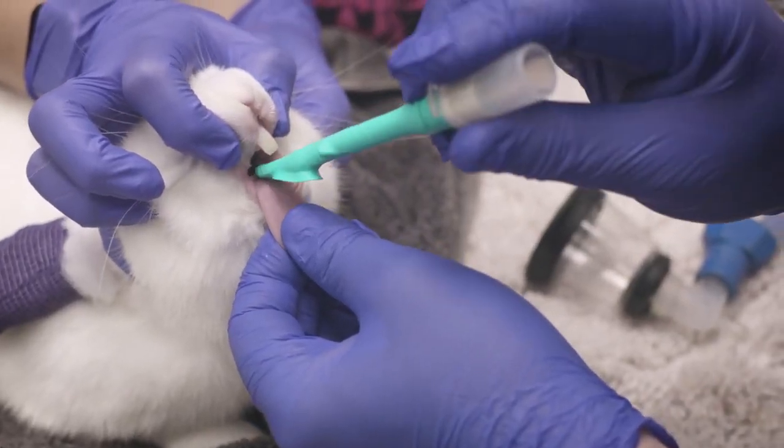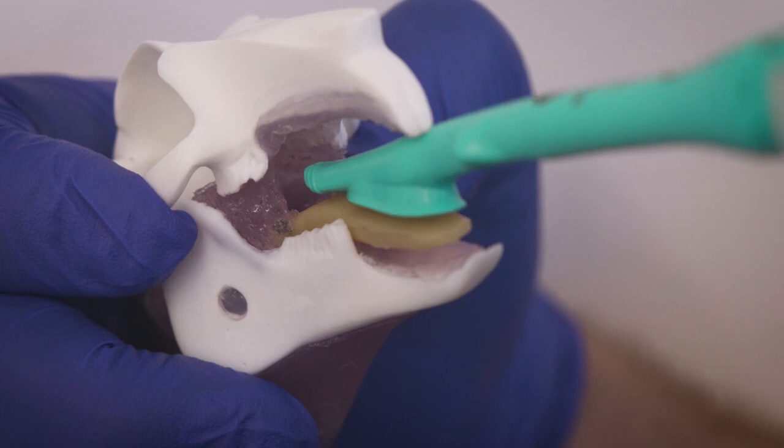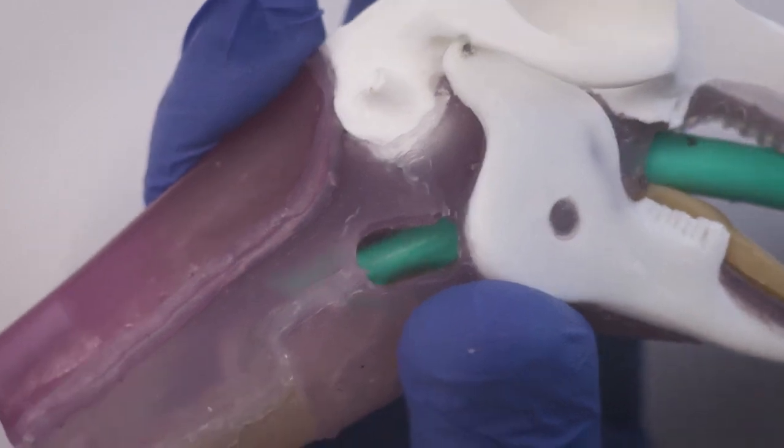Holding the patient's tongue, place the V-Gel on the tongue with the skirt splayed out, not tucked underneath. Gently advance the V-Gel into the pharynx. A subtle drop will be felt as the V-Gel passes over the base of the tongue and into position.